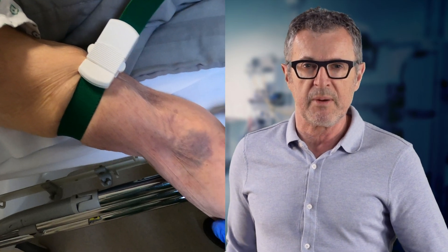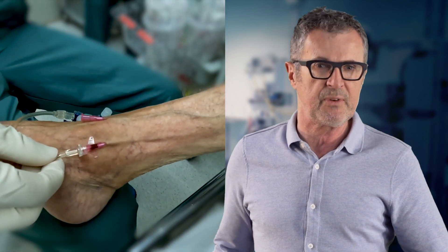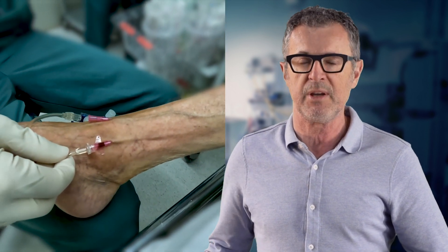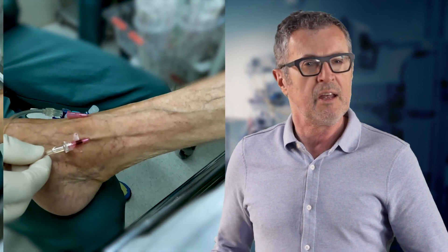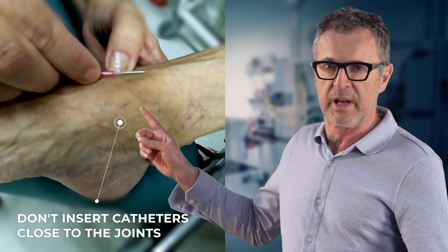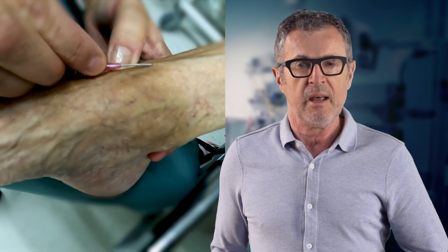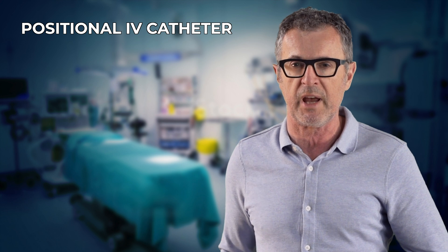When the veins of the upper extremity are inaccessible, the veins of the dorsum of the foot or the saphenous vein of the lower leg can be used. When using a foot vein for IV access, the first thing we should do is avoid insertion of the catheter close to the ankle, where it may bend. A bent or kinked catheter as the ankle moves will interfere with IV flow — something we refer to as the IV being positional.